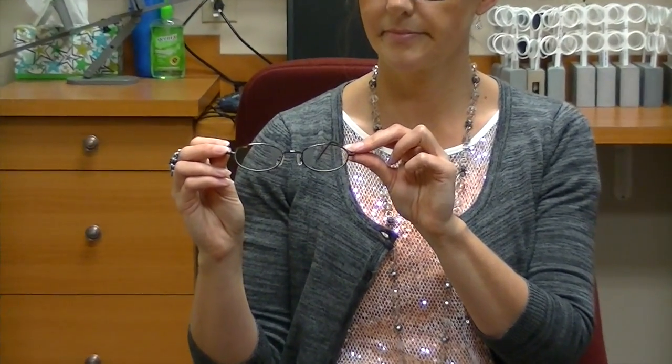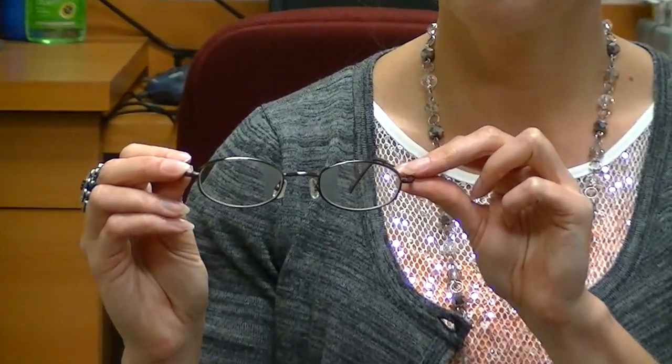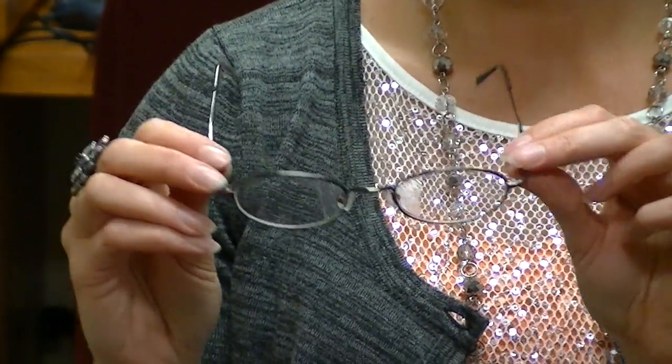So I want to show you the binasal glasses that I made not too long ago in the office. What they are is a covering that covers kind of like the inside of the lens towards the nose, which is why we call it binasal — two eyes, or two nose in.